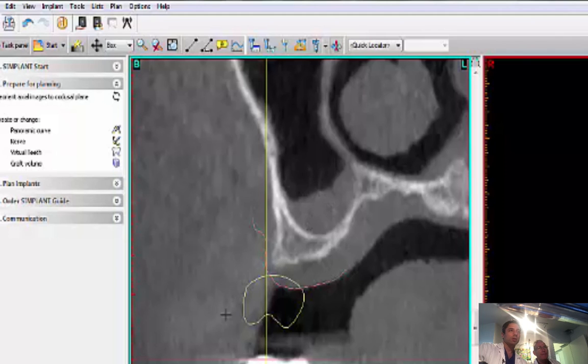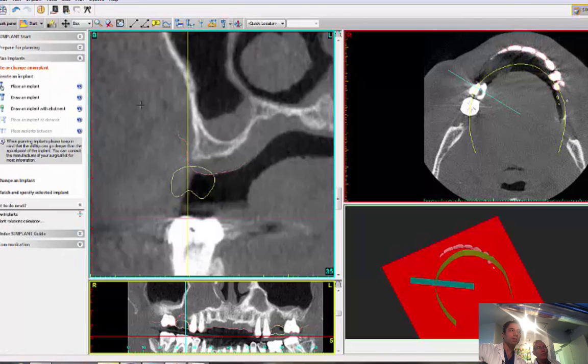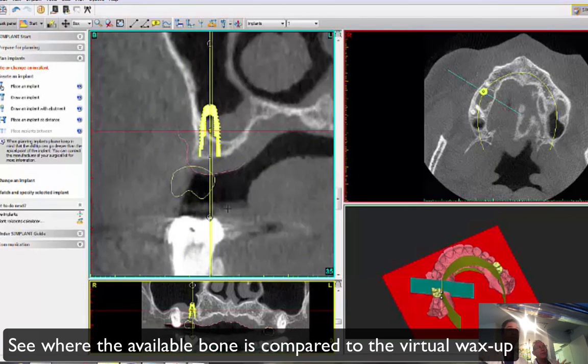We still throw an implant in there. Now you'll see the limitations — before we dealt with that during the procedure, now we can tell ahead of time.